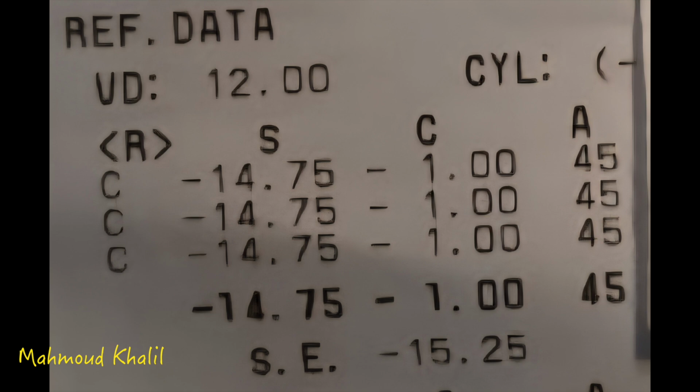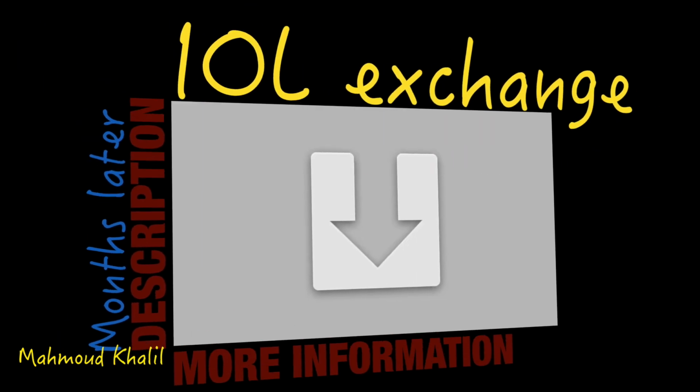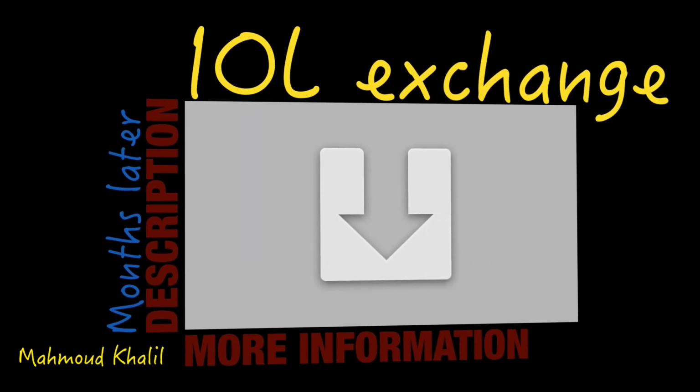And then the refraction after silicone oil removal was minus 14.75. So the patient has a myopic shift because the patient had cataract surgery at an early age. The decision was to make an IOL exchange and to make a new IOL calculation and go for this exchange.